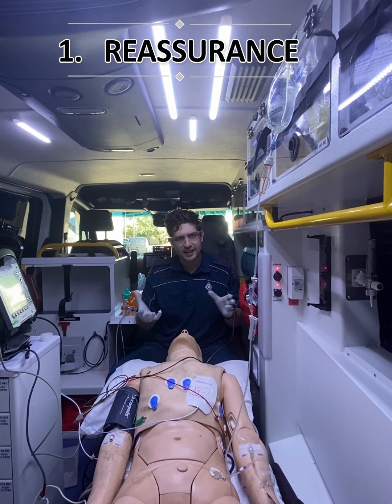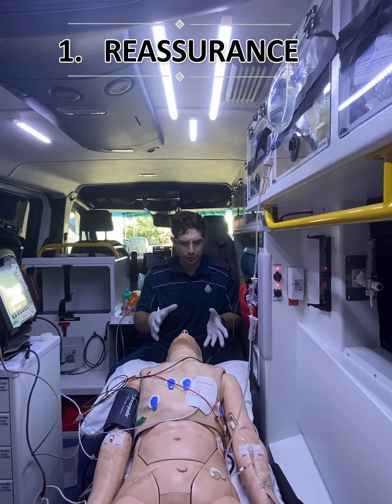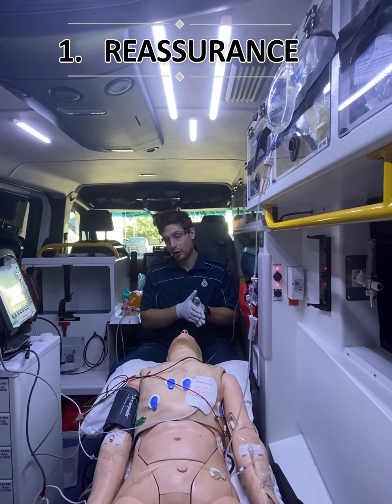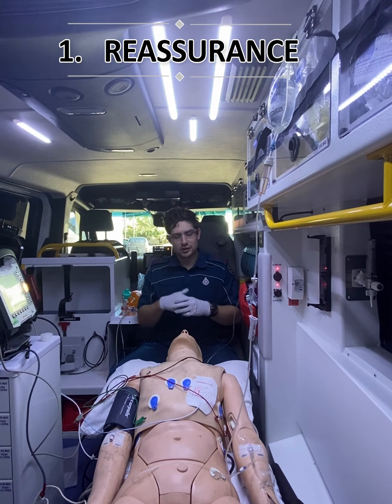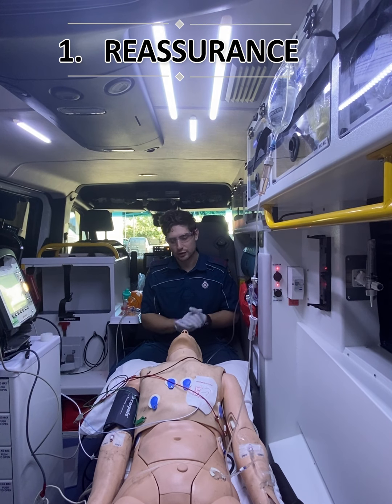So with setting up our procedure, our first step is going to be reassurance to the patient. Obviously this is a pretty traumatic event. We're going to be shocking a patient through their chest with a number of amps over possibly a long period of time. We need to get the patient on board. We need to inform the patient of what's going to happen. And we need to ensure that we are giving adequate sedation and pain relief, which we'll talk about soon.